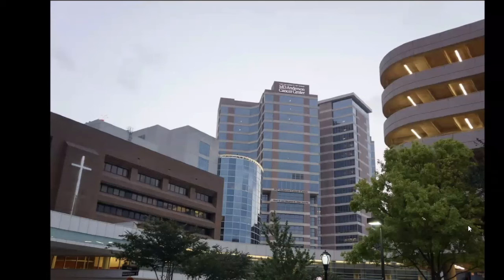So Sriram actually talks about he's using endo rings from US Endoscopy for high-risk screenings and polyps in difficult locations like around the flexures or behind the folds with very good results. It helps in withdrawal and flattening the folds.